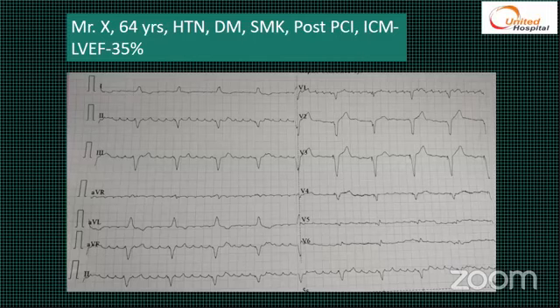And before we go for the permanent device, of course the ideal is to go for BIV, because this is going to be a big problem since the patient is paced all the time. So all these need to be addressed, because I'm not quite sure that when there is a number like 35%, we can jump on. We have the benefit of using a LifeVest, which is a wearable jacket, and giving all the guideline-directed medical therapy, including all pathways, reassessing the LVEF, and then thinking about the device, particularly when we are on the fence.